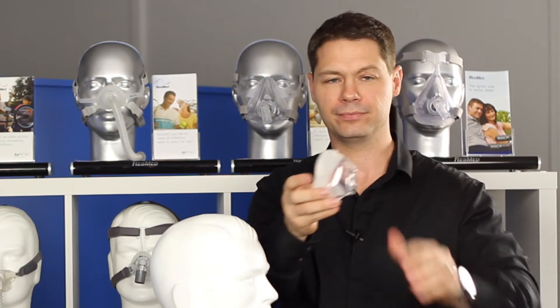The cushion is very soft, so there's a lot of cushioning in there, which means that on your face, it's very comfortable.